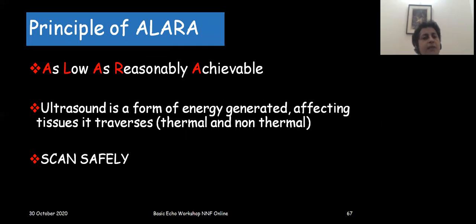While doing an ultrasound, we follow the principle of ALARA. That is, we should use settings as low as reasonably achievable, as low as needs to be set in order to get a good image. It is eventually an energy, and it affects the tissues it traverses, and it could have thermal and non-thermal effects, so we need to scan safely.